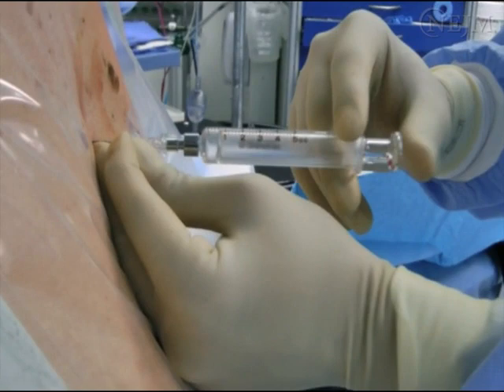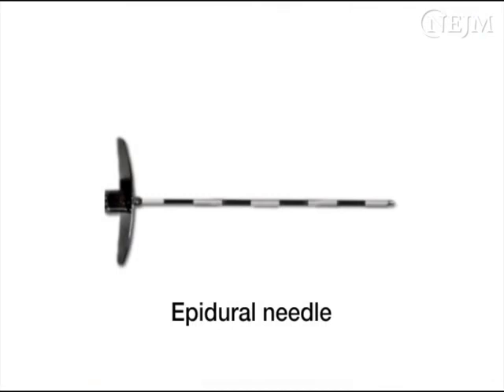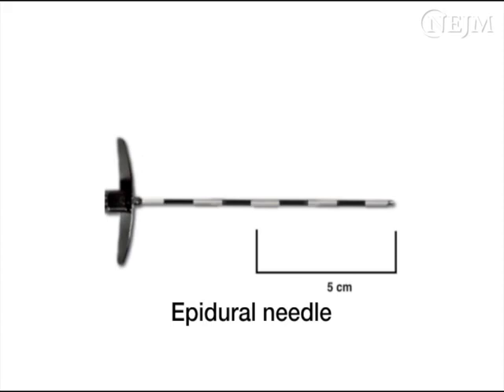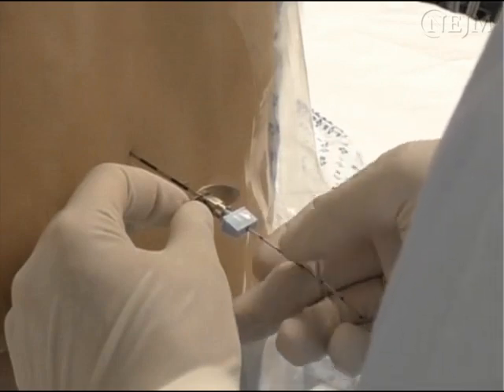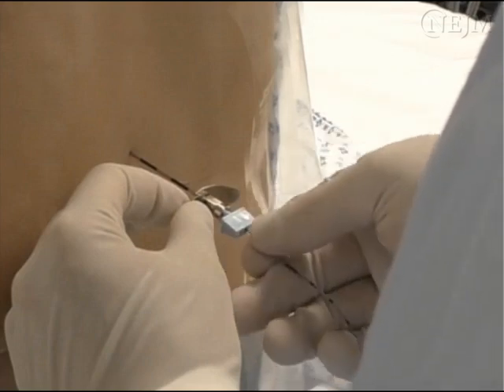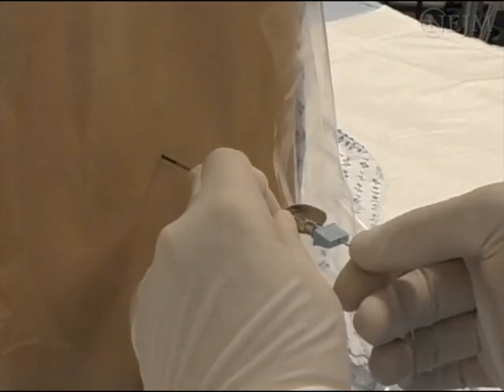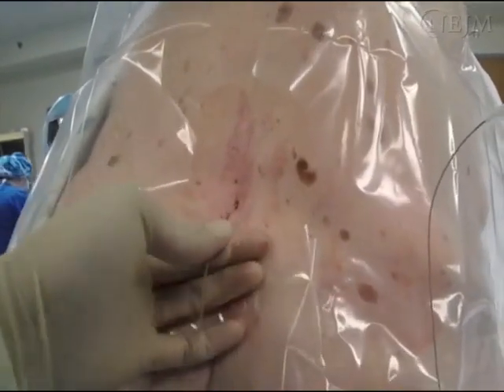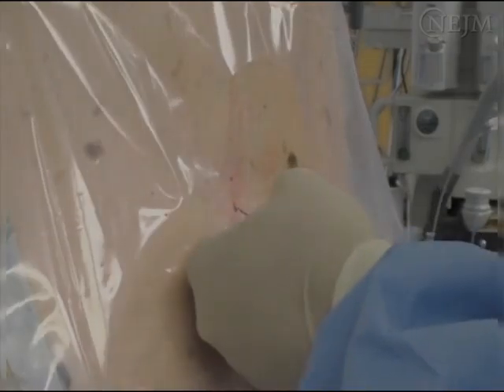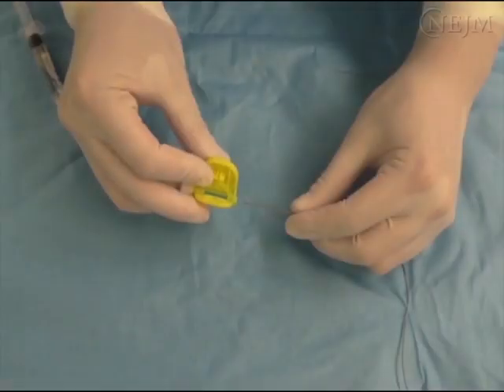Once loss of resistance is felt, note the depth at which the needle has entered the epidural space using the markings on the needle. For example, if using a 9-centimeter epidural needle and 4 centimeters remain outside the patient's skin, the distance from skin to epidural space is 5 centimeters. Note that longer epidural needles are available for obese patients. Gently pass the epidural catheter through the needle to a depth at least 5 centimeters past the tip of the needle. Do not withdraw the catheter through the epidural needle, as this increases the risk of shearing or dislodging the catheter. Withdraw the epidural needle over the catheter, then slowly withdraw the catheter, leaving 3 to 5 centimeters in the epidural space. For example, if loss of resistance occurs at 5 centimeters, the catheter should be taped at the 8 to 10 centimeter marking.